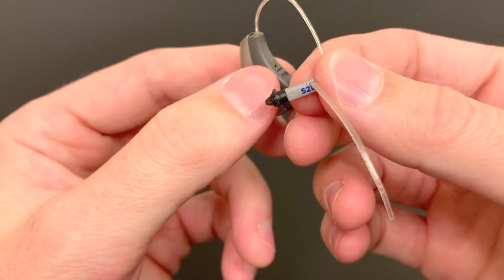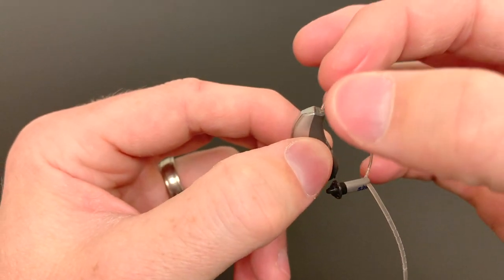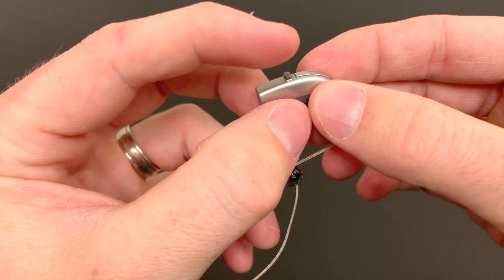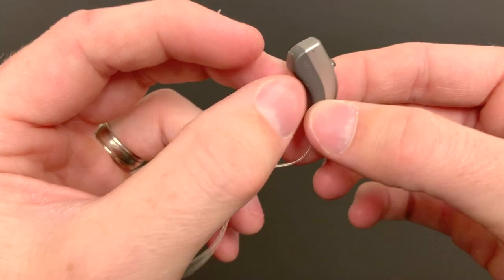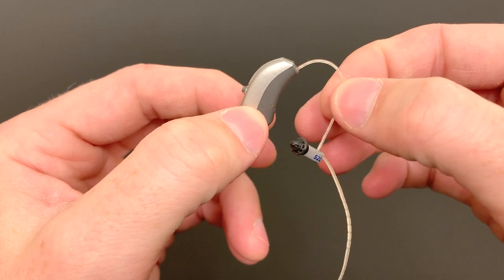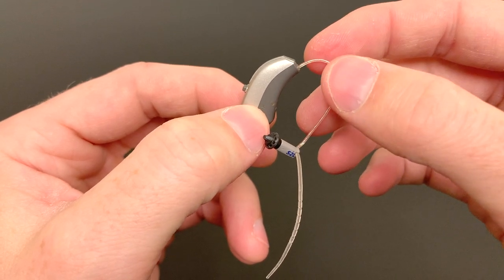The gray box here on the end is called the receiver with the wire that goes back to the hearing aid body itself. On the back, you have your program button and on the bottom is your battery door. That is the anatomy of a receiver in the ear or receiver in the canal hearing aid.